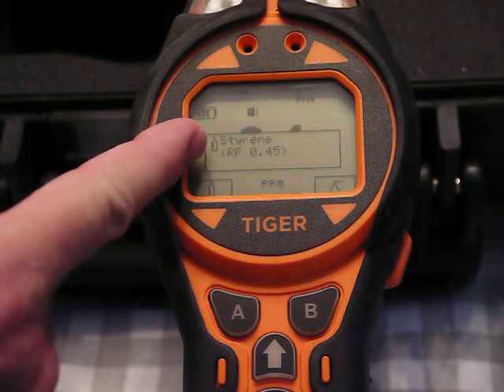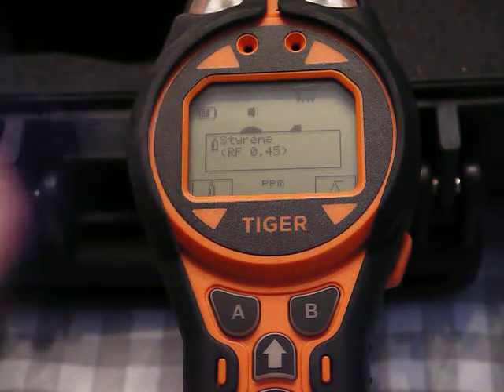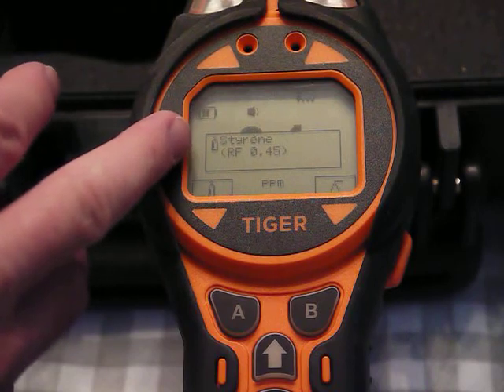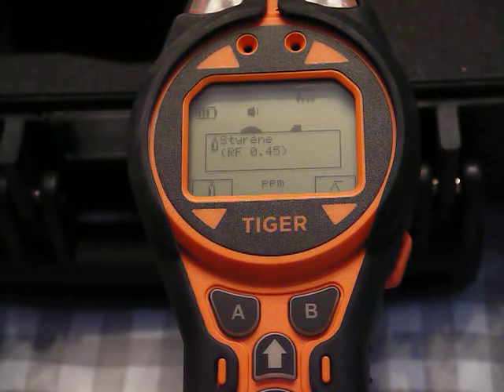This is very powerful if there's one known VOC present — you can dial in and read it directly. If there are three or four VOCs with different response factors it's less valuable. A lot of customers keep it at a response factor of one for general monitoring. If I accepted styrene, all readings would be multiplied by 0.45 — so 100 ppm isobutylene cal gas would also read 45.